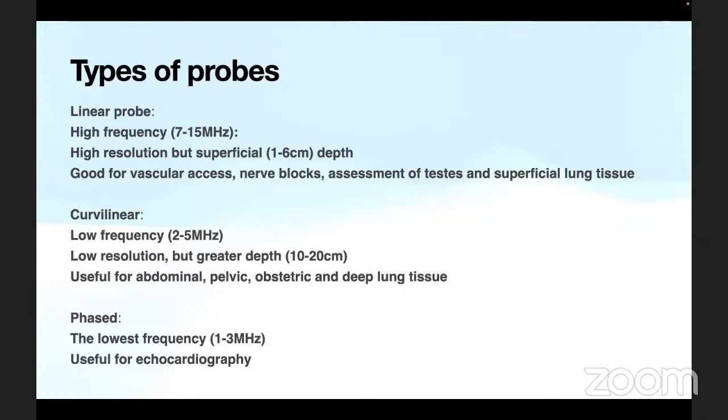This is very important because this will affect the confidence of the intensivist or the anesthesiologist, a new intensivist or anesthesiologist, because he may not be able to visualize what he wants to see, and this can deter the clinician from performing also in the initial phase because he is not able to visualize that. So selecting the right probe and using the right set of buttons to visualize what you want is very important, and we should keep an idea of what probes to use at what point.